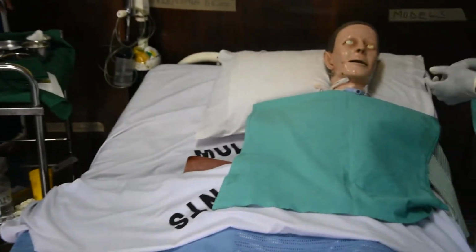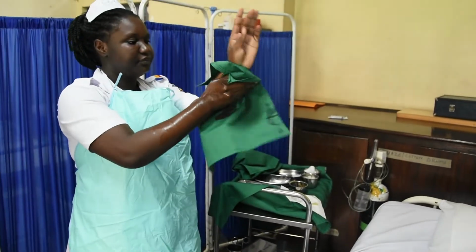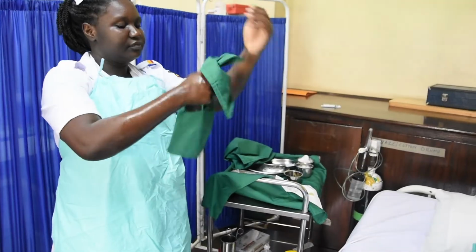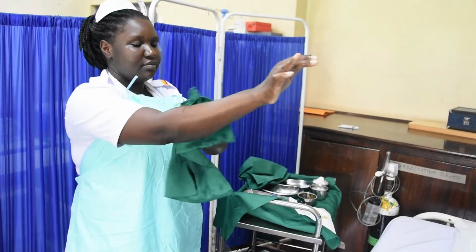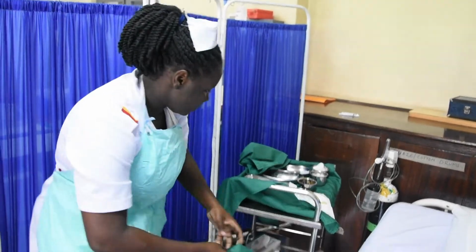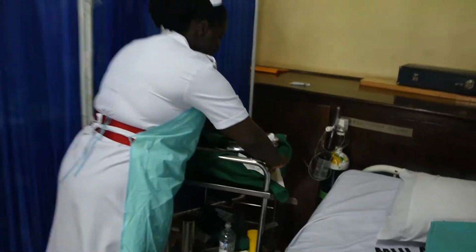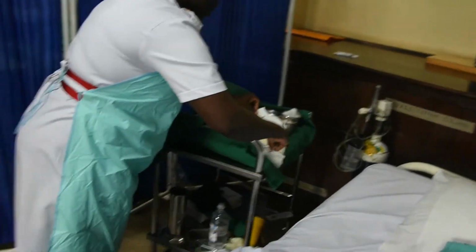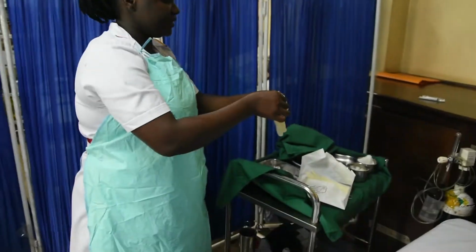And this time around, I'm using a sterile towel. So after that, I have to put on my surgical gloves.